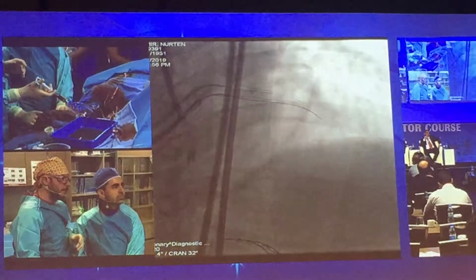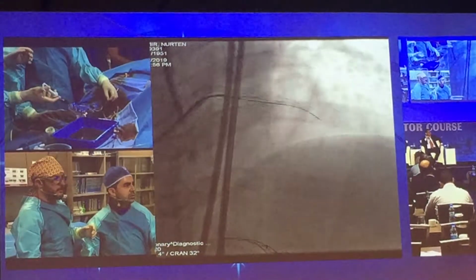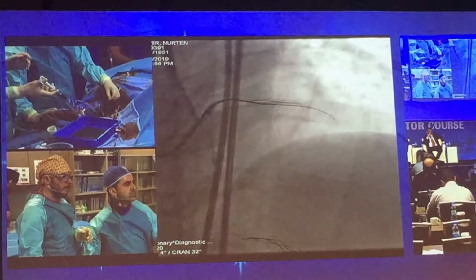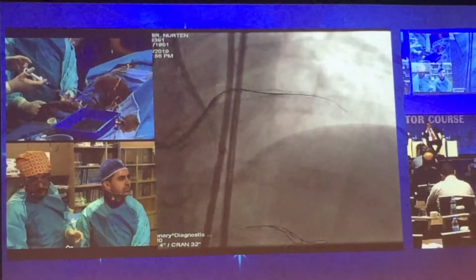Okay. How long should they deal with this antegrade, and when to switch to retrograde? Nazif, what do you think? For this case, do you estimate the time for this?